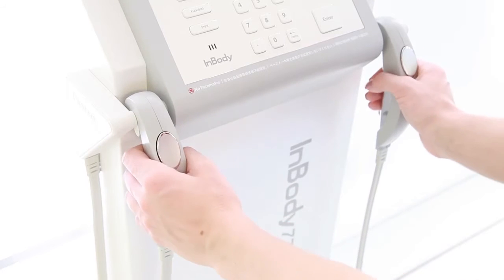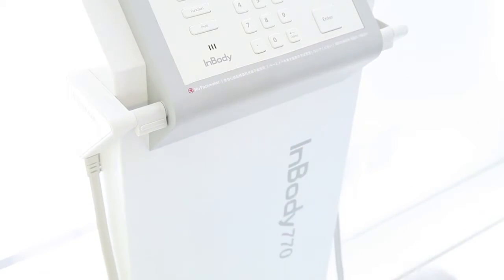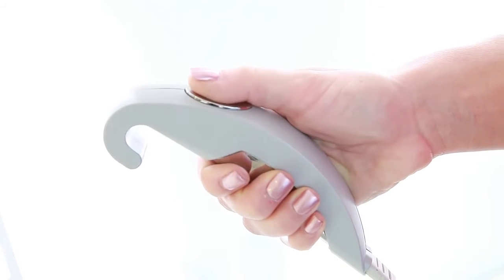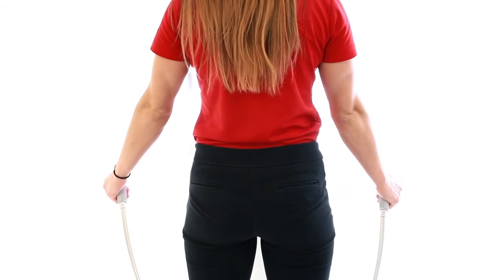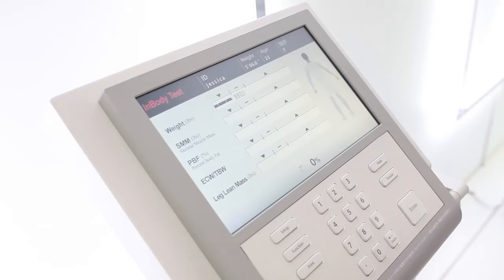Grab the handles and place your thumb on the oval electrodes. Keep your arm straight and away from the body. You may now relax and keep your body still until the test is completed.